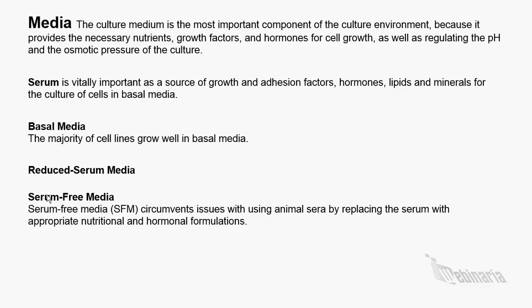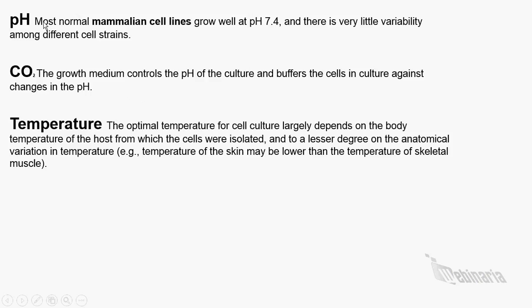What are the advantages of serum-free media? They have increased definition, more consistent performance, easier purification and downstream processing, increased productivity, better control over physiological response, and enhanced detection of cellular mediators. But they also have some disadvantages. For example, they need a very high degree of reagent purity. Sometimes growth is slow, and they require cell type specific media formulation. So these are the basic disadvantages.